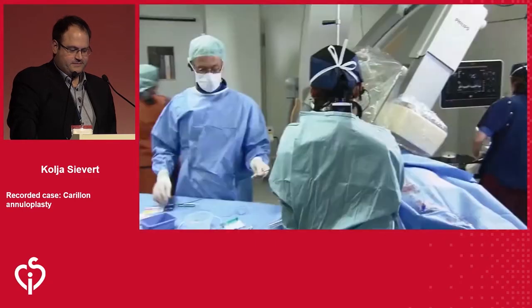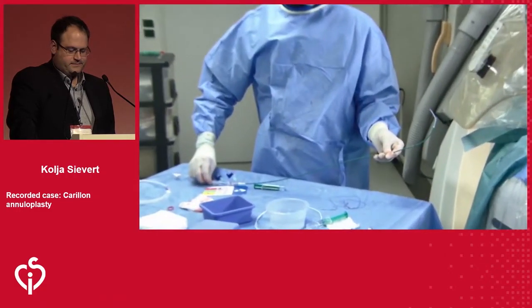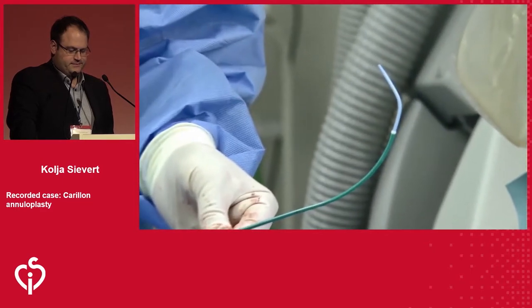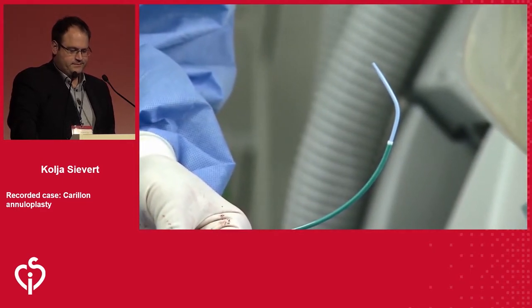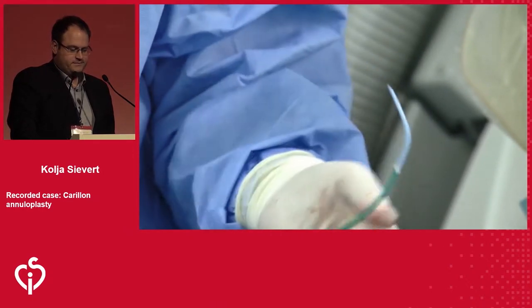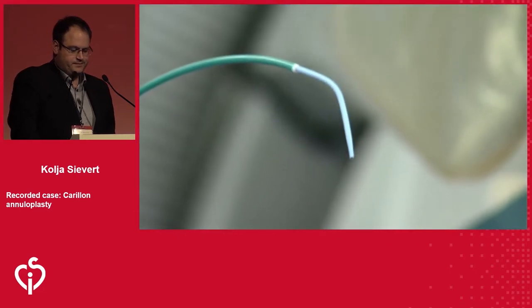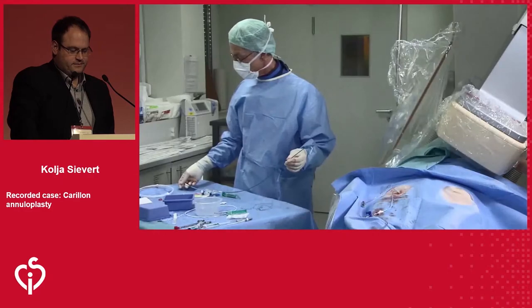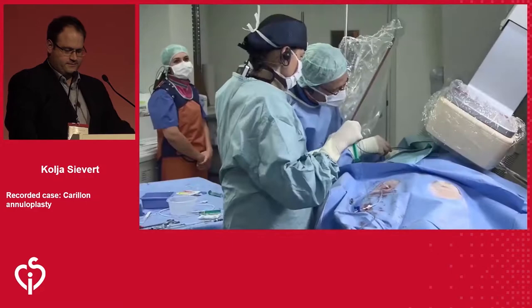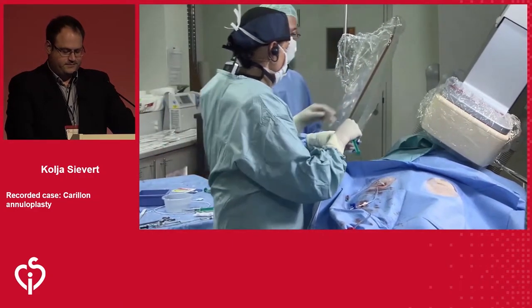The guiding catheter which comes with the device is shaped like a multi-purpose. It's a 9-French catheter, and you can see that I have inserted into that 9-French catheter a 7-French multi-purpose catheter in order to have a smooth transition between the tip of the guide and the diagnostic catheter. Inside of the system, there is a hydrophilic glide wire with an angled tip. So now I'm introducing the system into the 9-French sheath.